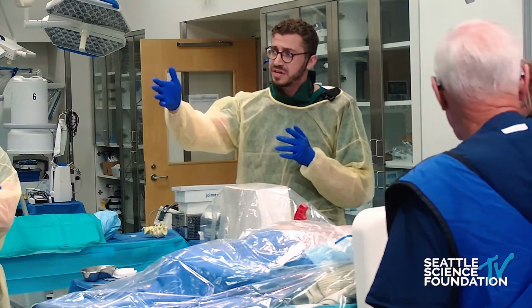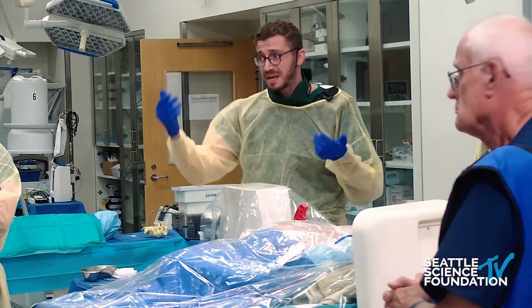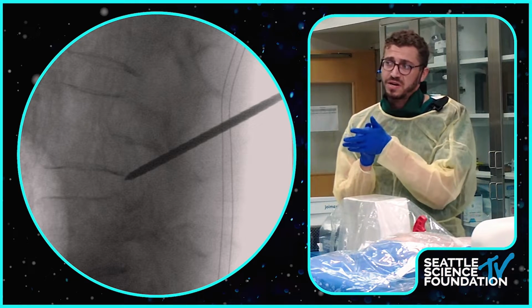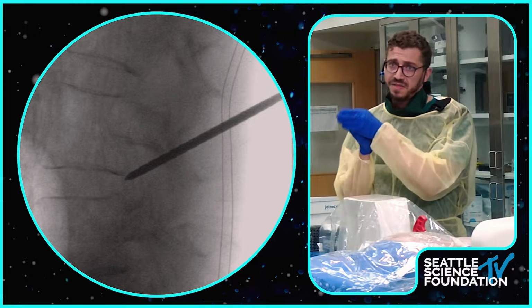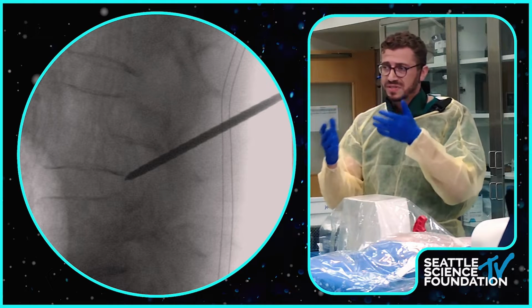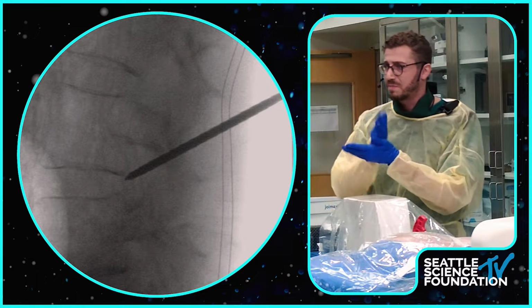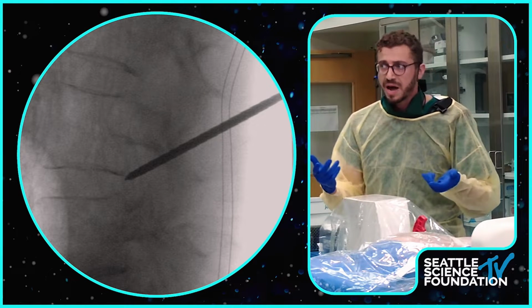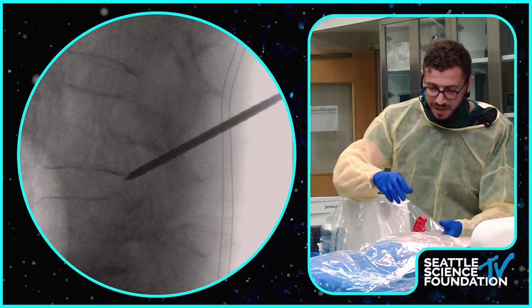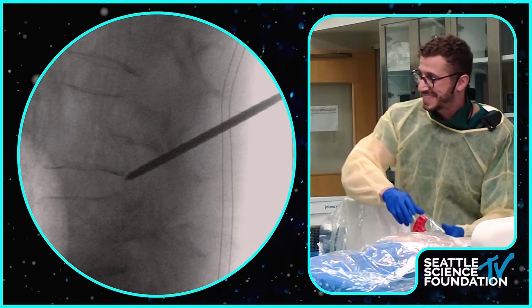So in this situation here, you see the foramen is huge. I tried to aim for the SAP, but it kind of slid into the foramen. So this is actually a great starting location. You're at the PLL on the lateral, and on the AP, you're on the medial pedicle line. We're at L3-4, so this is a level where you decide whether to aim for the mid pedicle or medial pedicle. That just depends on your preoperative MRI. But here, this should be a good place for us to start. And if you all have any comments or anything, please chime in.